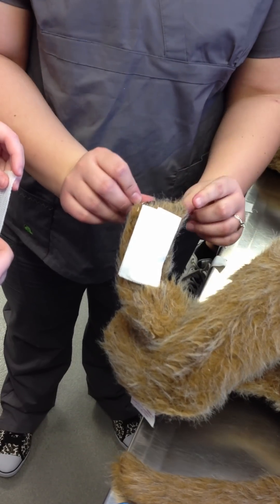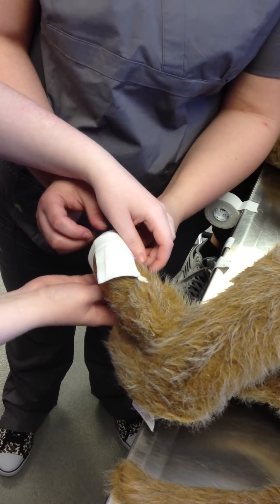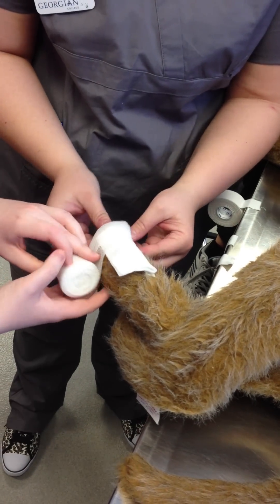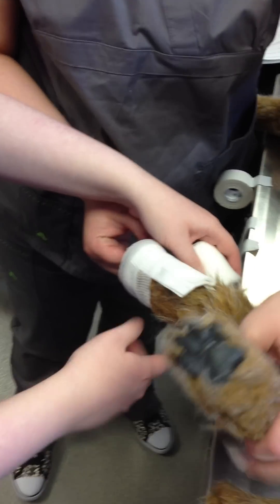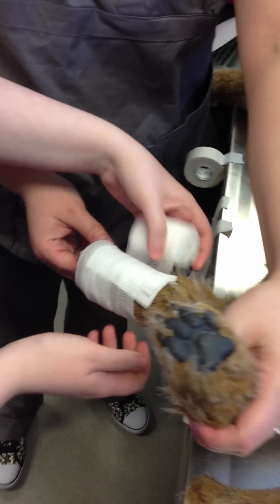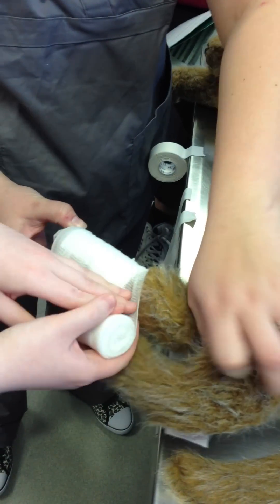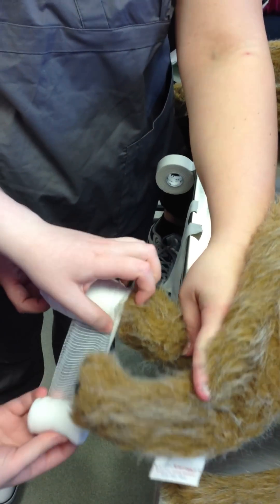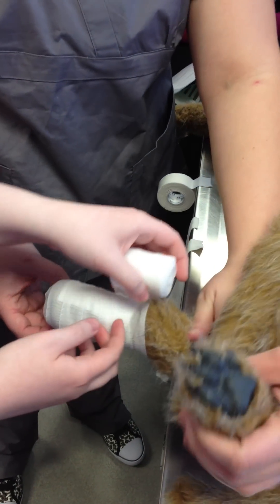So you've got to make sure your two toes are exposed. Would it bleed if it was like the amputation of the one that was actually attached? Depends on if the surgeon is able to find all the bleeders or not. If it is a major attachment and the surgeon is concerned that it's going to bleed, they might ask you to put a secondary layer in.